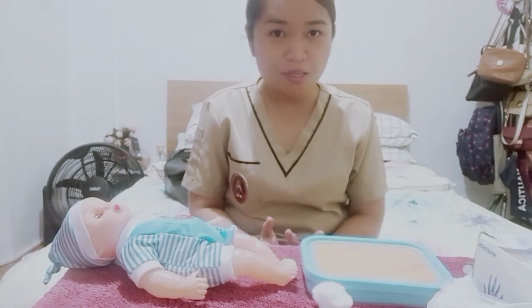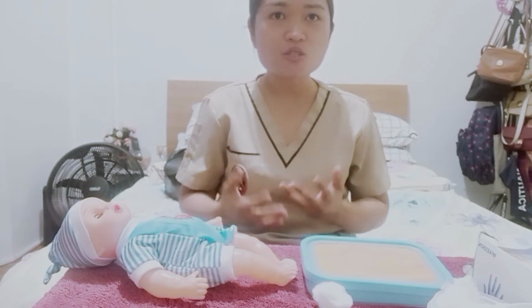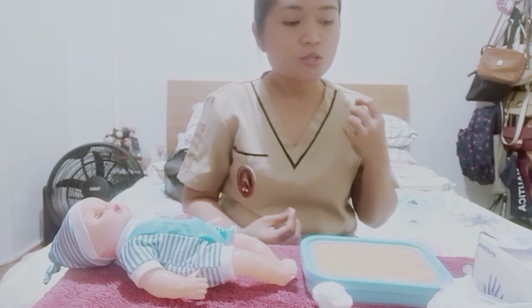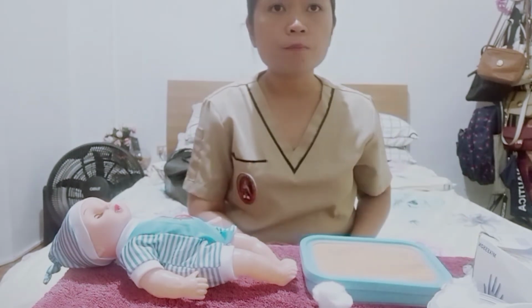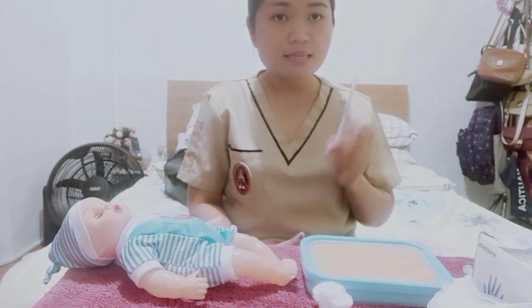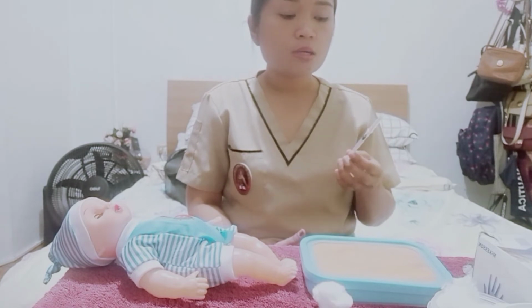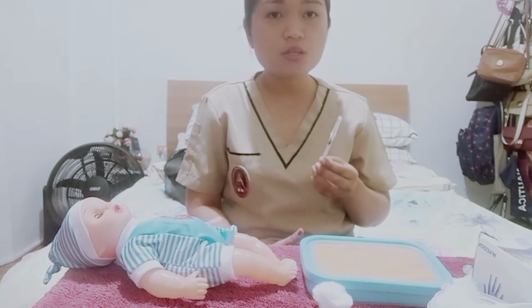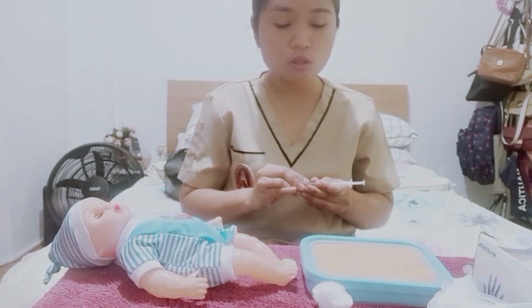Now, for subcutaneous injection, we are going to administer the injection at a 45-degree angle on the skin of the patient. Okay, so in doing the subcutaneous injection, we are going to need a 25 or 26 gauge, 16 mm length syringe. Okay, so let's just pretend that this is that kind of syringe. So this is how we're gonna do the subcutaneous injection.